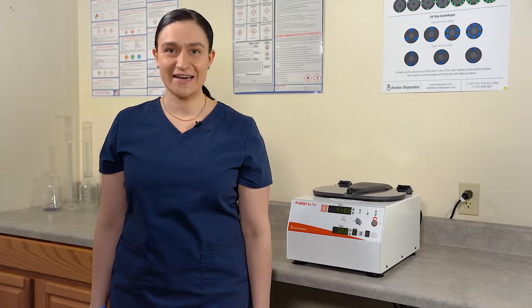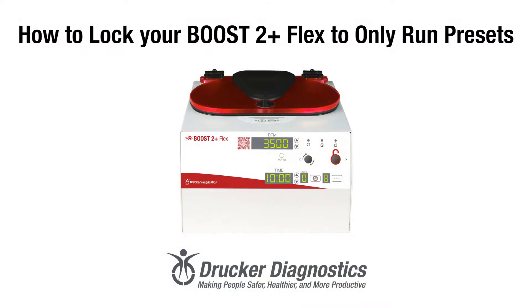Hi, I'm Dawn with Drekker Diagnostics, and today we're going to lock your Boost 2 Plus Flex centrifuge to only run its saved presets. Presets Only Mode: how to lock your Boost 2 Plus Flex to only run presets.